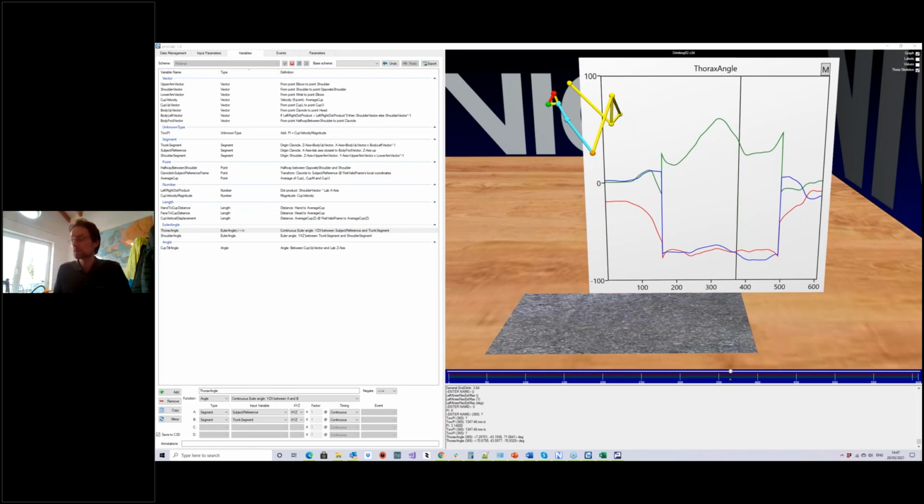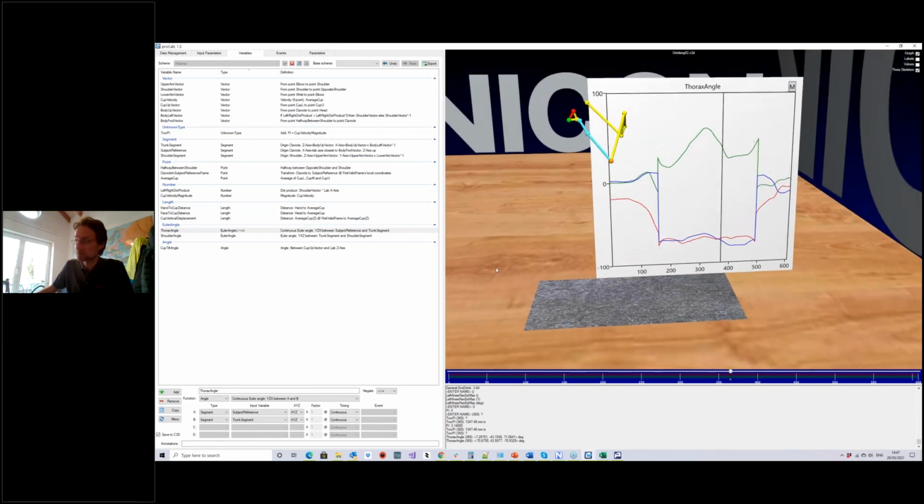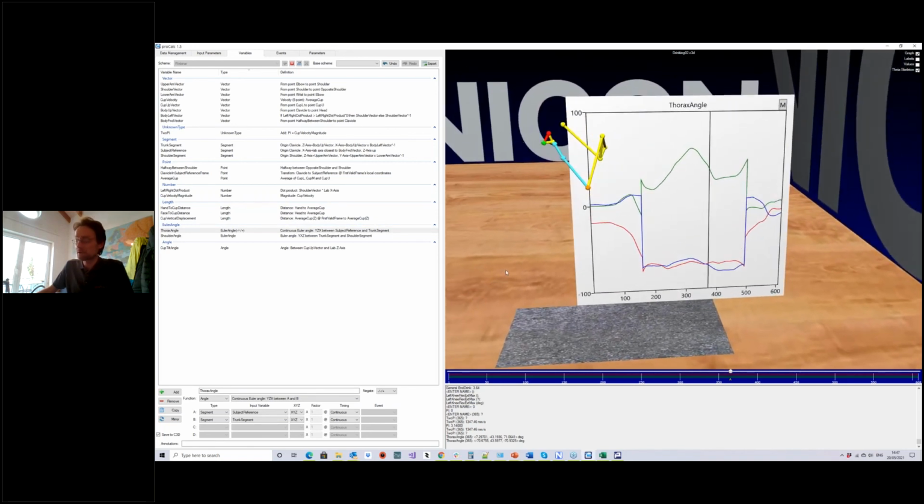ProCalc needs a more flexible way of storing the calculated values, such as the units, multiple components, etc. So the XMP is, as the name implies, an extension to the MP file.